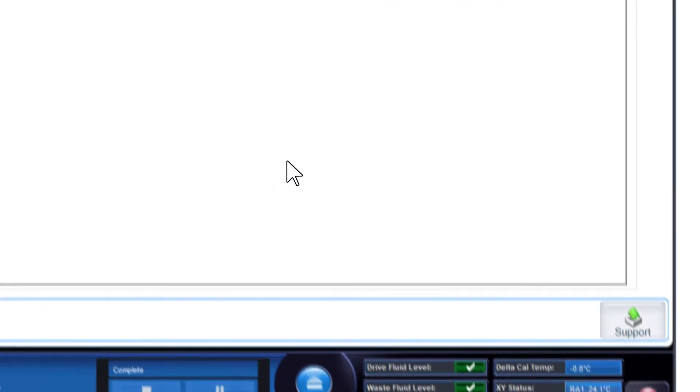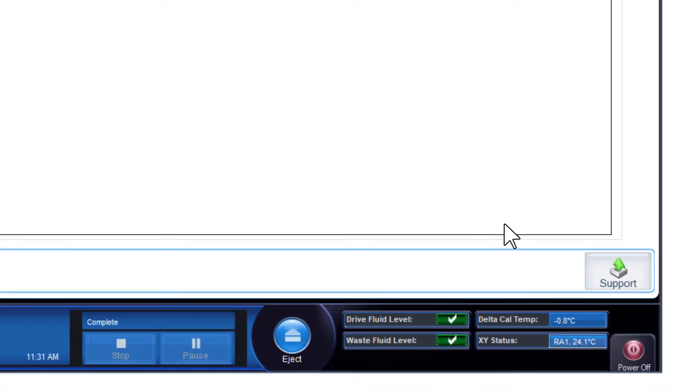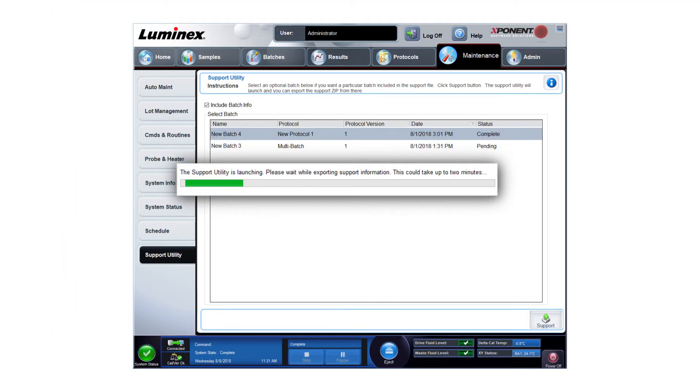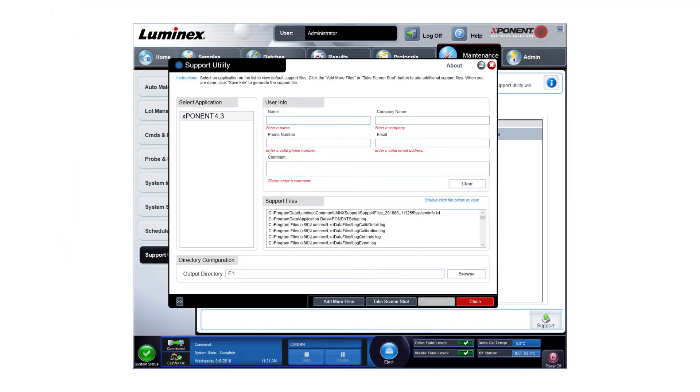Next, click the support button located at the bottom right of the screen. A progress bar displays, then the support utility window opens.